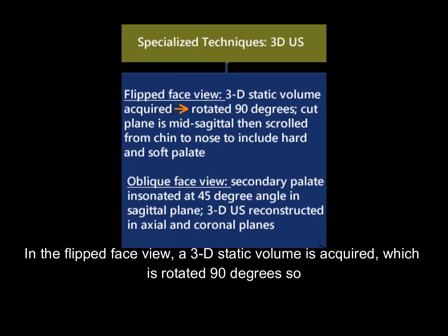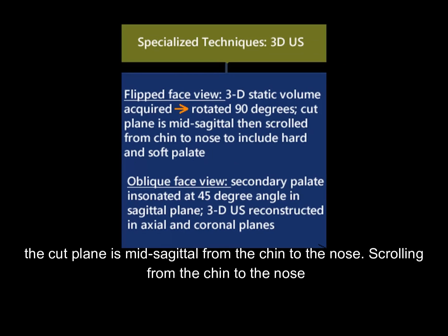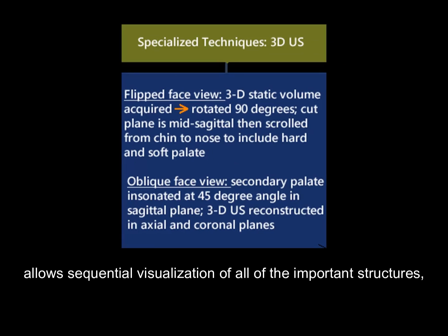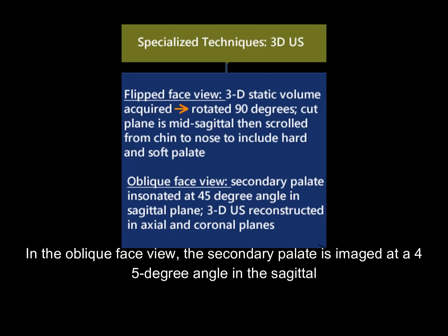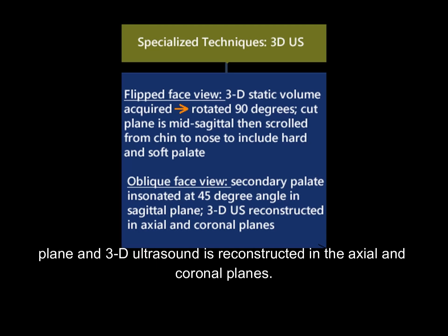In the flipped face view, a 3D static volume is acquired which is rotated 90 degrees so the cut plane is mid-sagittal from the chin to the nose. Scrolling from the chin to the nose allows sequential visualization of all important structures, as well as the hard and soft palate. In the oblique face view, the secondary palate is imaged at a 45-degree angle in the sagittal plane and 3D ultrasound is reconstructed in the axial and coronal planes.